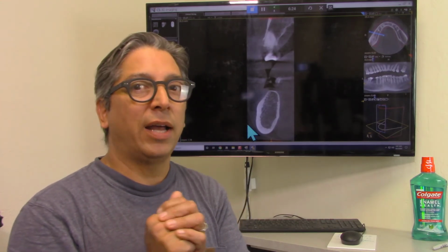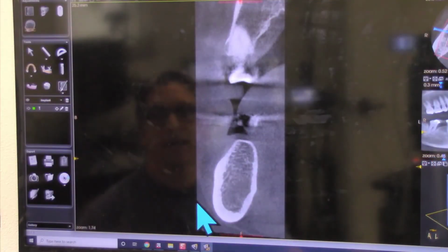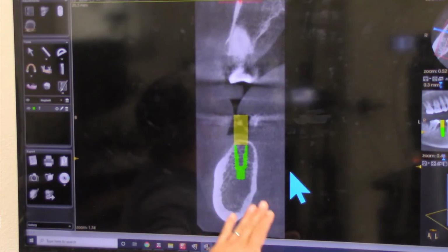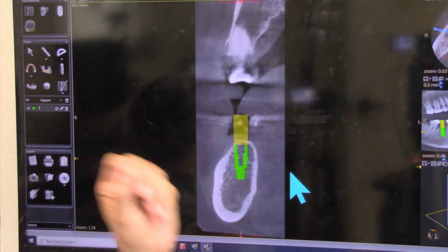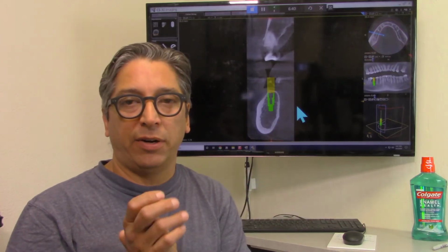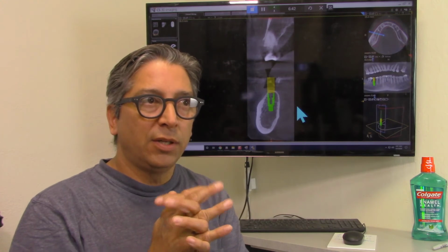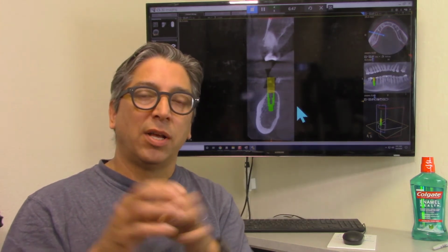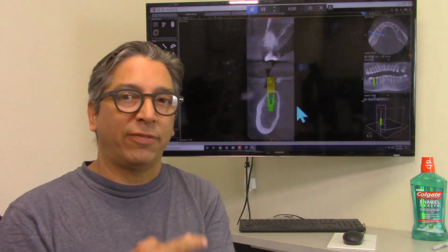And in fact, what I do, in this case I have an 11.5 millimeter implant, so I will only open up the cortical nature of the bone here, but really just use a very short drill, like a 7 millimeter drill that gets me to a 4.5 millimeter.